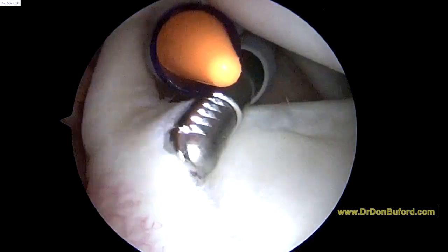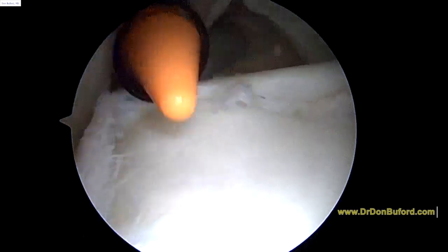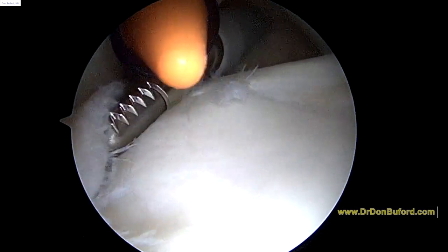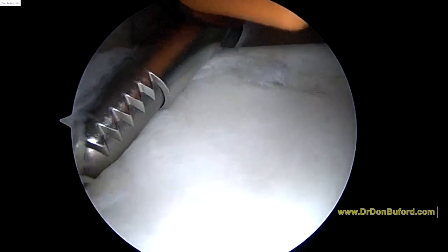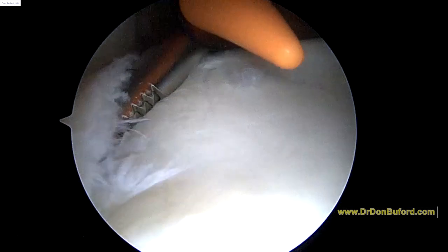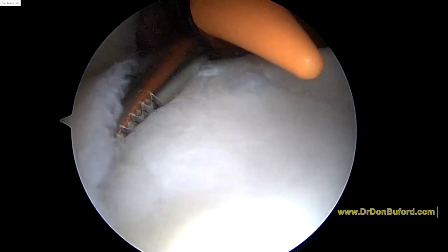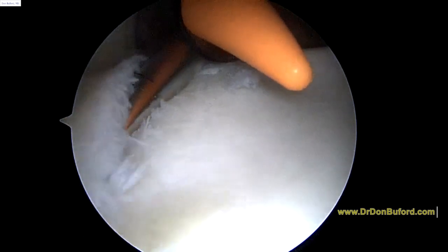And the other thing that I can do now that will save us some time is we can debride the cartilage where the SLAP lesion is. So down here, we'll start the shaver. This takes off the cartilage so that we can get a nice repair zone for the biceps anchor. So we'll keep working here and we'll show you some more in just a minute. Pause.